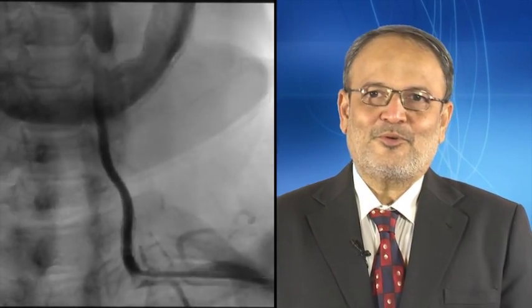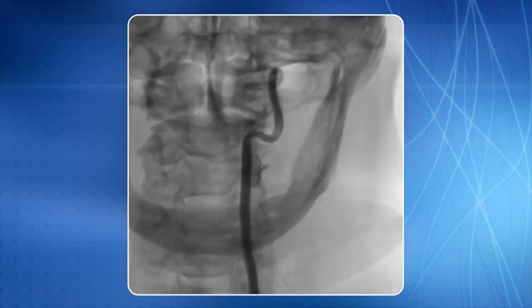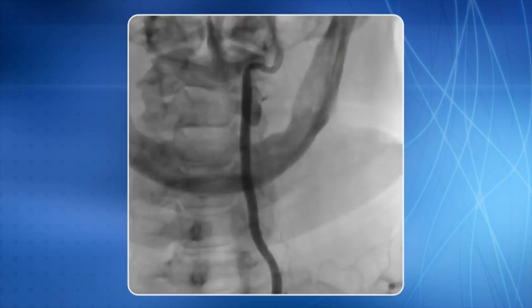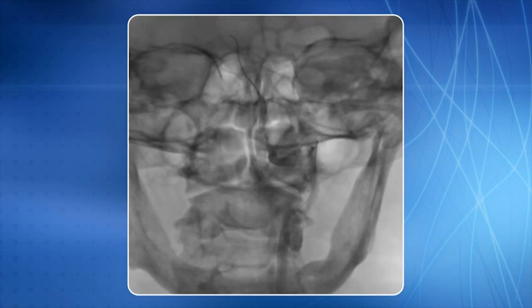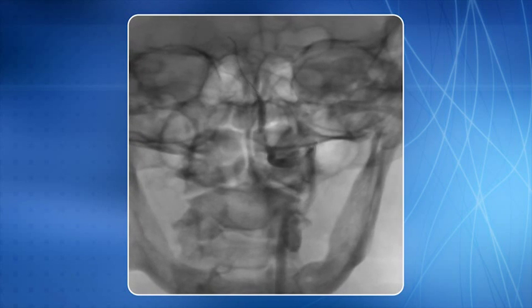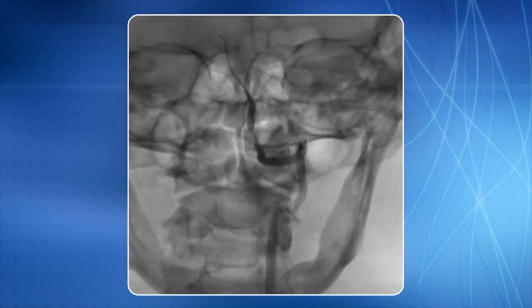This is a case of stenting of chronic intracranial left vertebral artery stenosis using the left transradial approach. The lesion is profiled. Note that the ostium of the left vertebral artery is cannulated using a 6F internal mammary artery guide catheter. A 0.014 inch BMW PTCA guide wire is negotiated across the lesion and the tip is parked distally in the basilar artery.